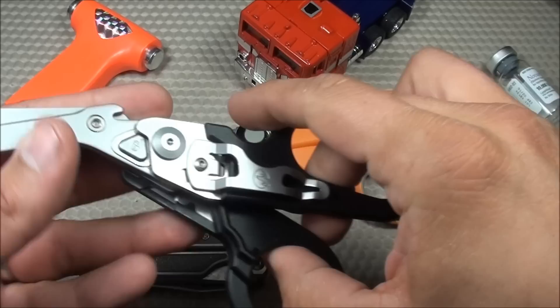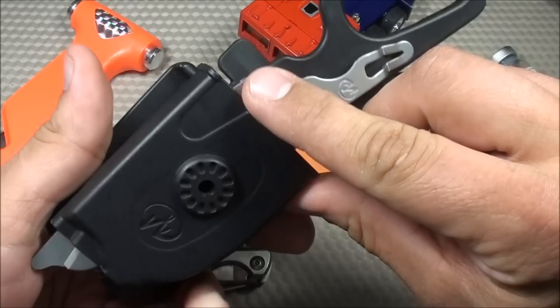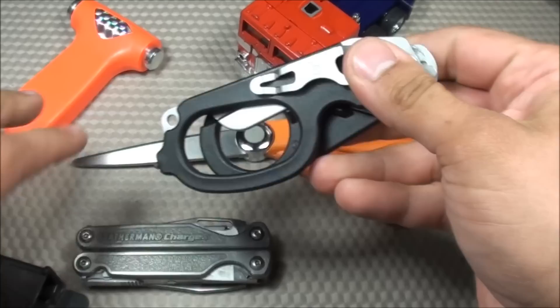It also includes a MOLLE compatible polymer holster so you could have it on your belt — it locks into place. There's a little emergency release, and you can make it ambidextrous for right- or left-handed use. And if you don't want it sticking out on your belt, you can transform it back and collapse it just like a standard multi-tool, using the pocket clip.